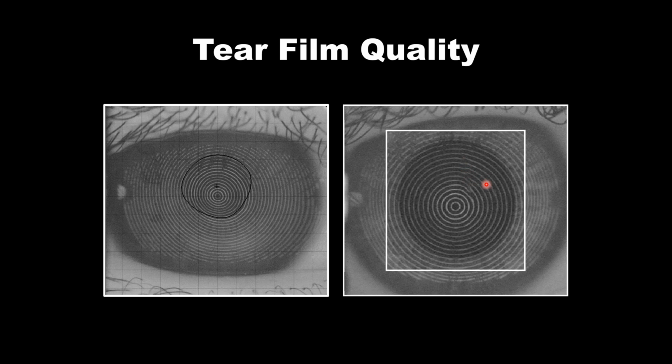So what's happening is either we have staining on this cornea, generally it's scarring that causes the Placido to distort, but it could very likely be just tear film breakup. So make sure at the instant you capture your topography that the rings are reflecting in a smooth, parallel, and even manner. When you capture your topography photo, you don't want to do it immediately after the blink. You want the tear film to even its way out.